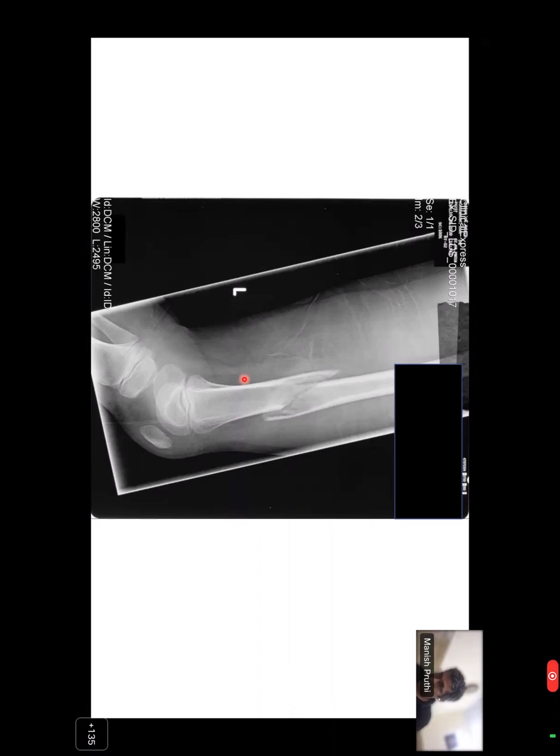Yes, sir. I understand there's a fracture and that is the most obvious thing that you see here, but don't jump the sequence. Where is the lesion? What is the lesion doing to the bone? What is the bone response? Then anything suggestive of histology, which is the matrix. If you go in this sequence, I think you will be able to reach a diagnosis.